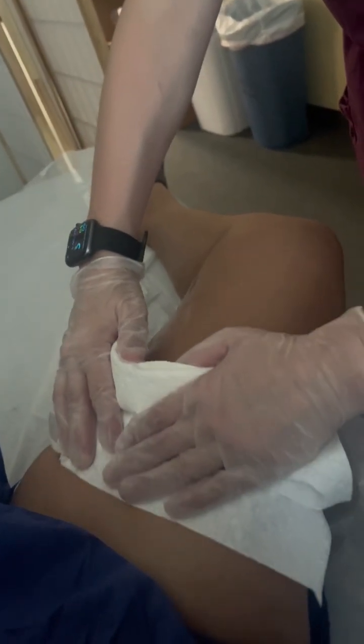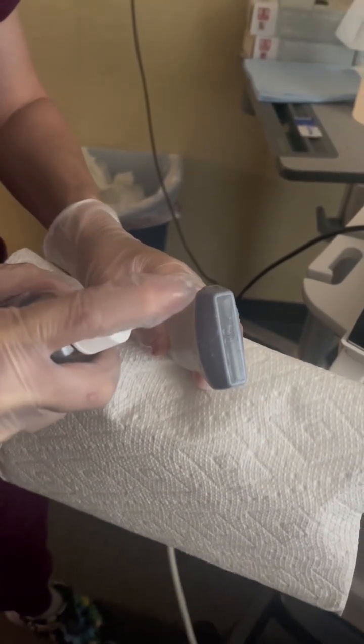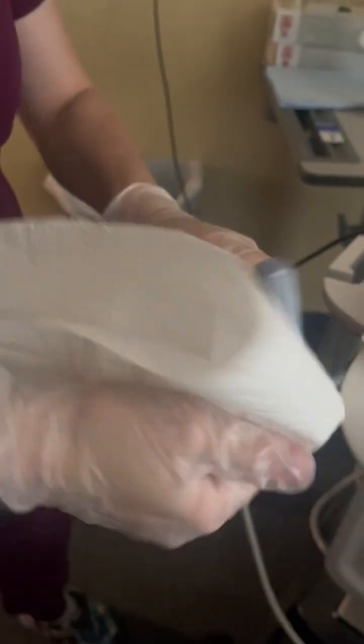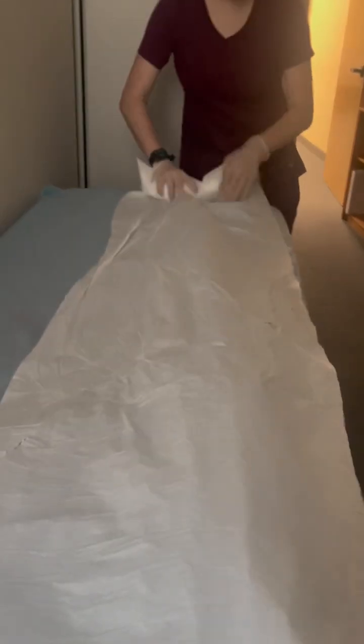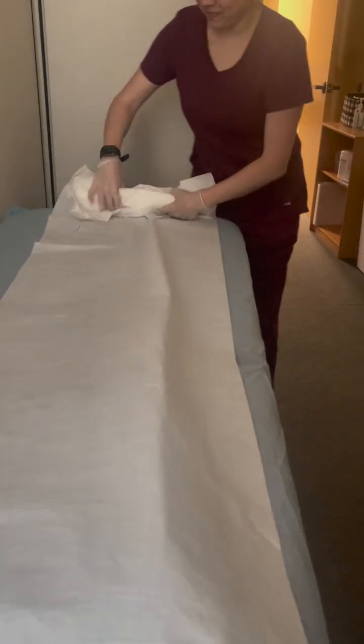Once the protocol is finished, you're going to grab a paper towel and wipe down the patient. You're then going to get a sanitation spray and wipe down the probe with a paper towel, but always make sure to wipe down carefully. Once finished with the patient, you're going to wrap up the paper sheet and get a brand new one so that we can work on our next patient. And that is my capstone 3 skill demo. Thank you so much for watching.